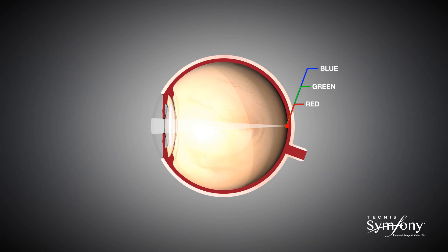But achromatic technology applies this principle to not only reduce chromatic aberration, but to correct the chromatic aberration of the natural eye.